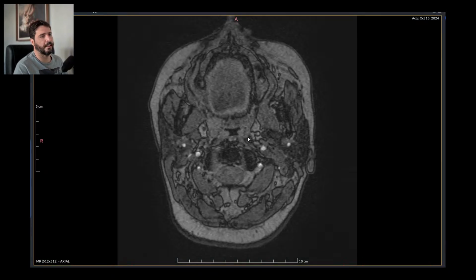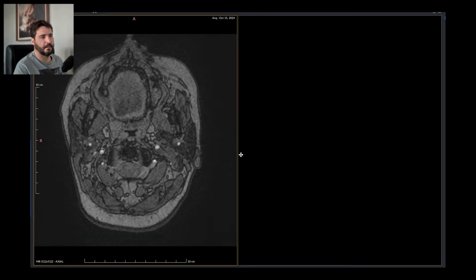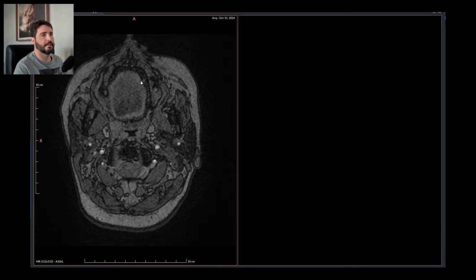It says the patient reports pain in her head. So due to headaches, migraines, we are here for an arterial MRI angiogram of the brain. Let's see if we can find any signs of an aneurysm. It's here already. A time of flight unenhanced noisy sequence. Let's hit an MPR. So we have an MPR.